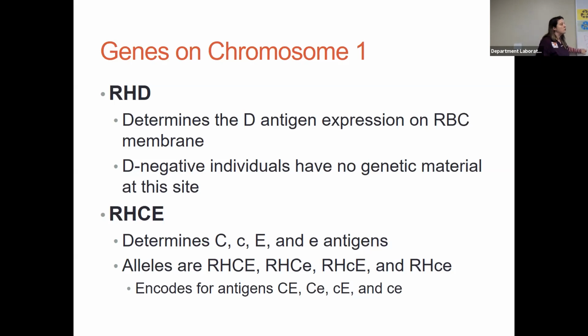All right, again, I want you guys to understand this is an amorph. There is no little d antigen. That's why on your IAT screening cells and your panel cells, all you see is D, okay? You don't have D and then another column with little d. You're not gonna see that because there is no little d antigen, right? That's just the way we notate it, meaning that your patient is Rh negative. Okay?